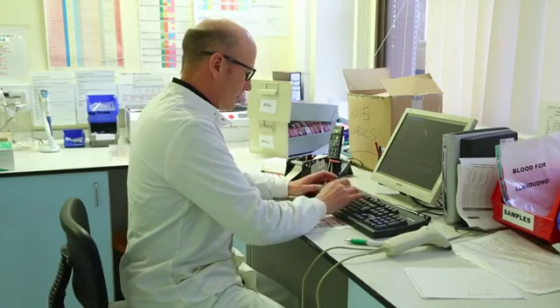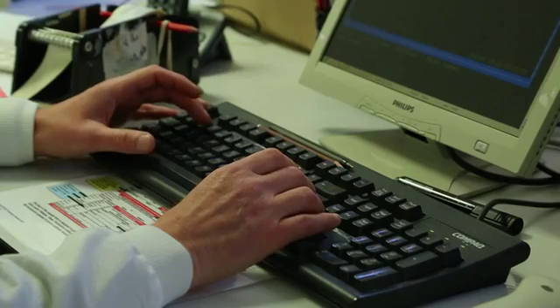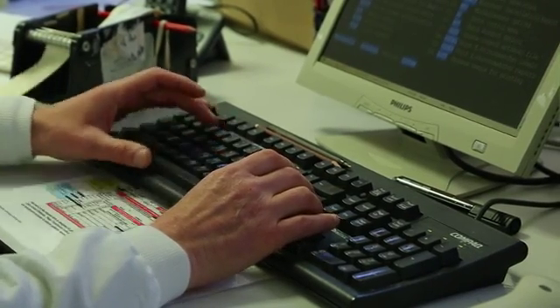So what sort of procedures are there in place to prevent any wrong transfusions from occurring? Well, as I showed you the machine earlier and told you how secure it is, there is no human intervention. The results are transmitted into the hospital LIMS, we call it database. The actual database has an algorithm in it which will block the release of the incorrect blood group, so it's a very safe system.